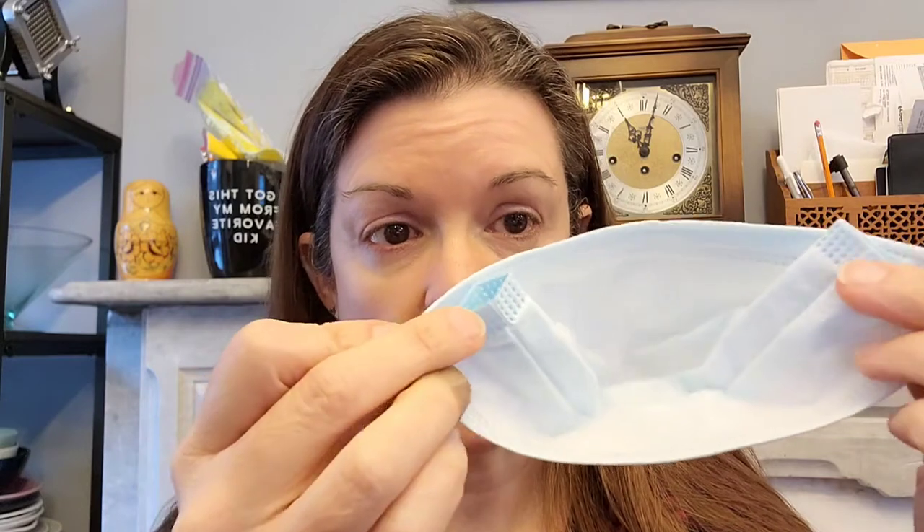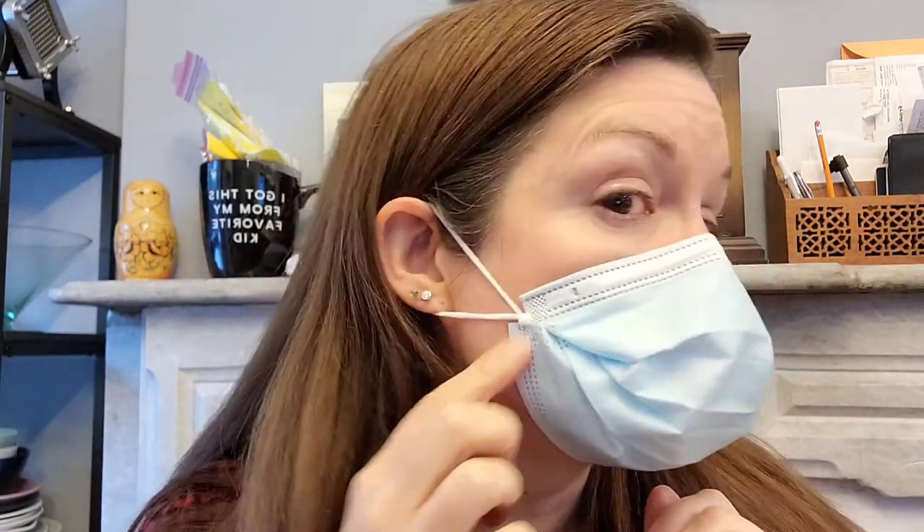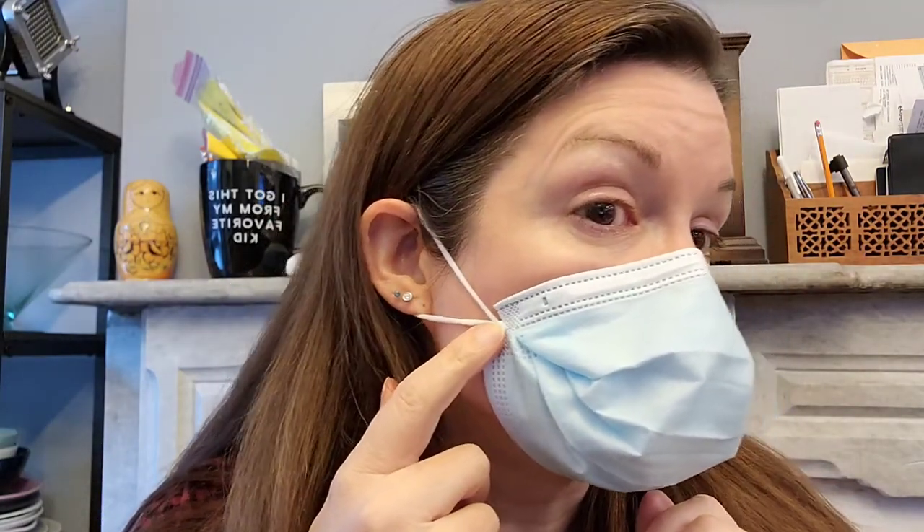We have our mask with this part flattened up against the top half. We're going to bend it over our nose just like usual, get those ear loops on, and hold it here while we pull it under our chin. Look at that — no gap. It's all being held in by this knot.